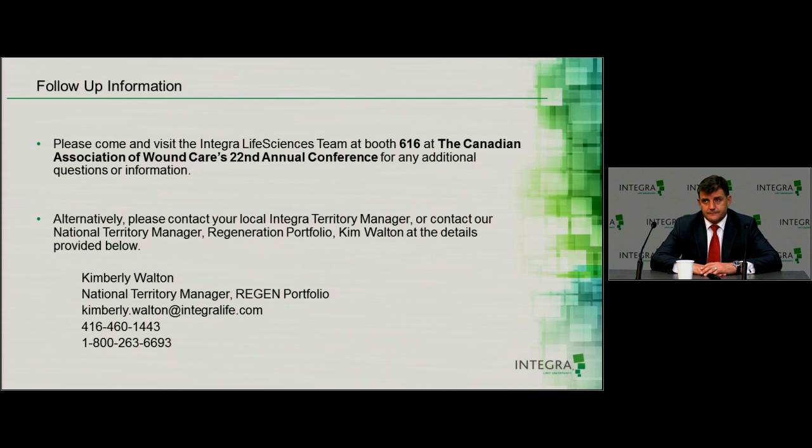Do you use negative pressure wound therapy, and how is it different than IDRT? So I've been talking about negative pressure wound therapy in conjunction with IDRT. So obviously, I use a fair amount of it. Negative pressure wound therapy shows its primary benefit in reducing the volume of the wound, by reducing the depth about 75% and the area by 25%. So in other words, it fills space.